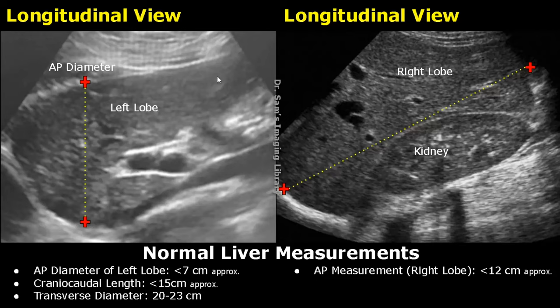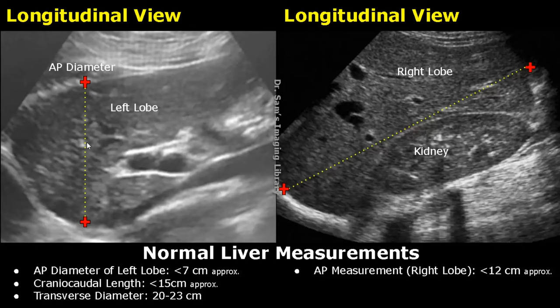This is the left lobe of the liver in longitudinal view. For the left lobe, the AP diameter is approximately less than 7 cm. To measure the AP diameter, place one caliper at the anterior margin of the left lobe and the other caliper at its posterior margin.